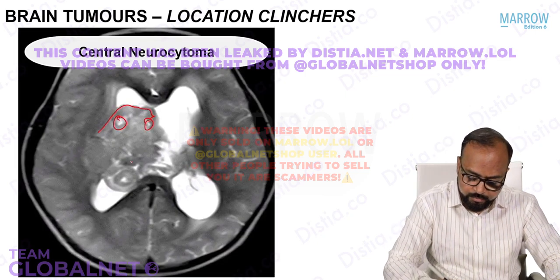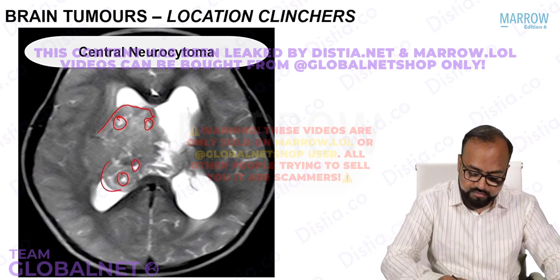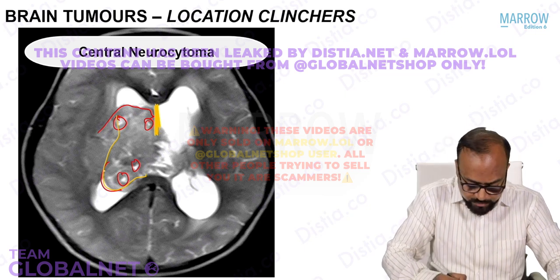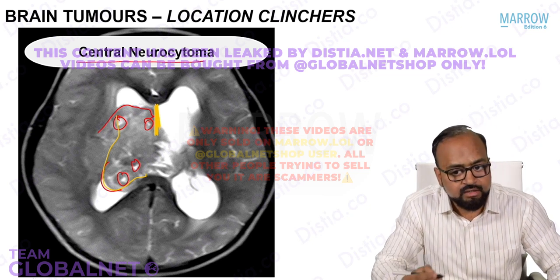Because there are multiple cystic spaces within it. It is located where? It is located in the body of the lateral ventricle here. Can you see? Close to the septum pellucidum here. So this is the septum pellucidum in the midline. It is closely related to the septum pellucidum. So this is a very typical location of a tumor which is called central neurocytoma.